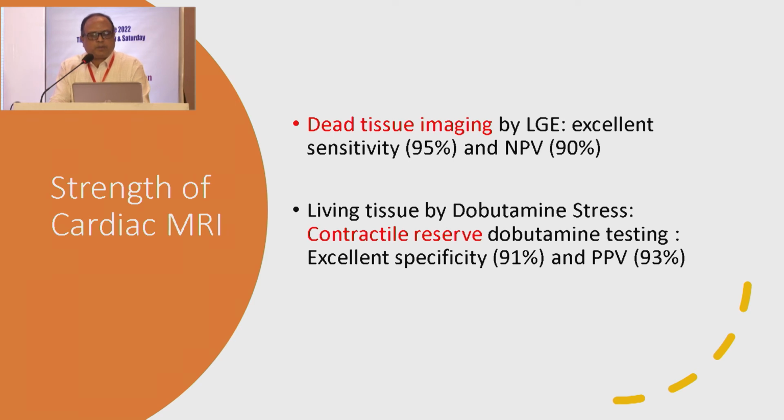So the strength of CMR is to detect dead tissue imaging. LGE is excellent for sensitivity and negative predictive value. And for contractile reserve imaging, it has excellent specificity and positive predictive value.